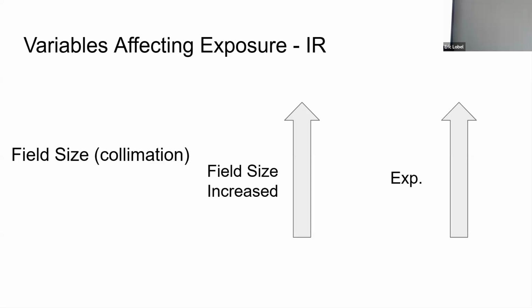Okay, we're going to talk about this in a minute, but I feel like talking about it now. It's my class. So kV increases scatter. Why? And think about pool tables, if you want to use that analogy.